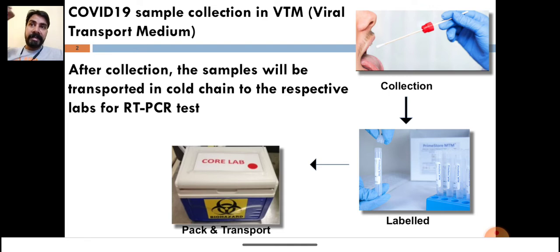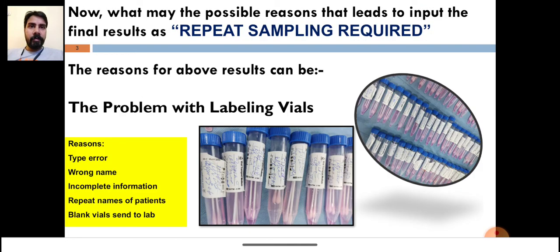From here, the reasons of repeat sampling required arise. Moving on to the next slide, what are the reasons that lead to the final result as repeat sampling required? The very first reason is the problem with labeling the vials, the VTM vials.